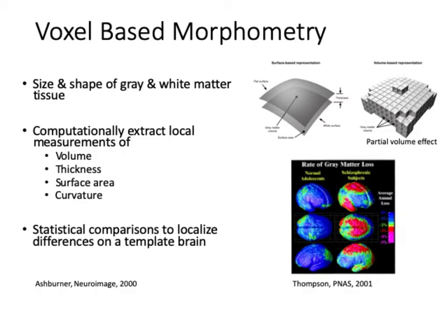As all of you are well aware, MRI images represent the three-dimensional brain as a stack of cubes, illustrated here, where each cube actually has an intensity value, which hints whether it is a gray matter tissue or white matter tissue or elsewhere. Voxel-based morphometry can be performed with two approaches. The first approach, called volume-based segmentation, tries to identify voxels that are associated with only gray matter or only white matter. And it also tries to map the location of individual voxels to known brain regions.